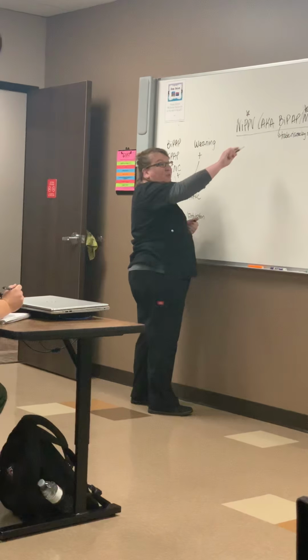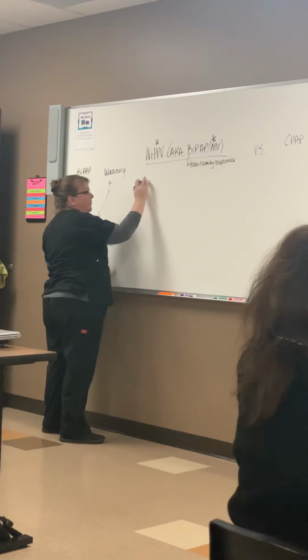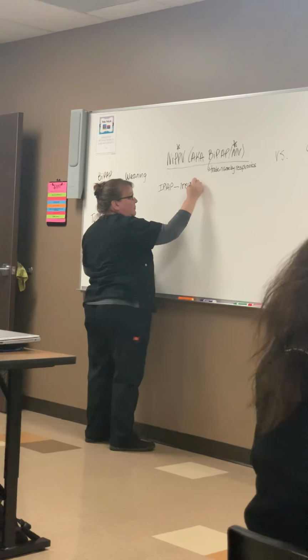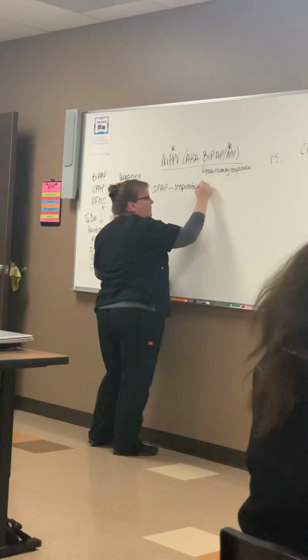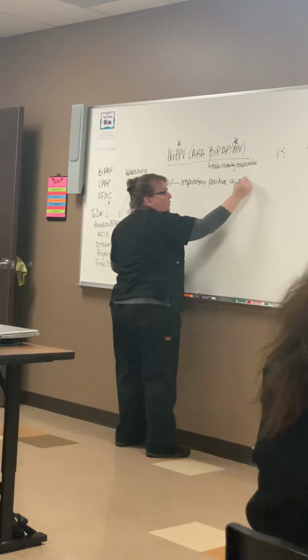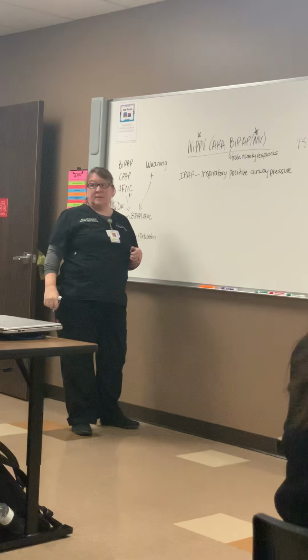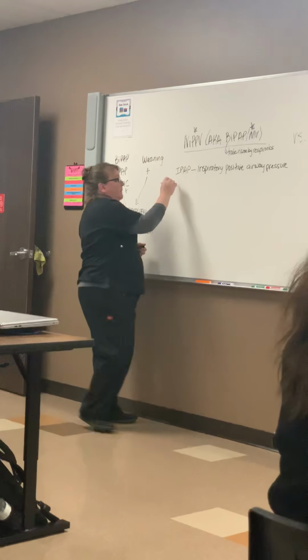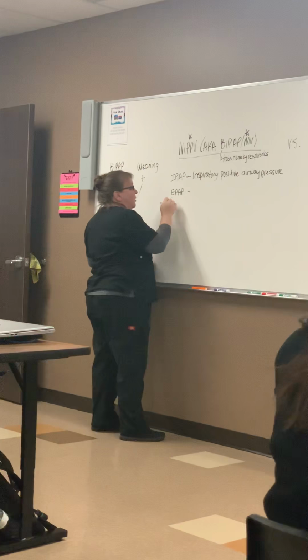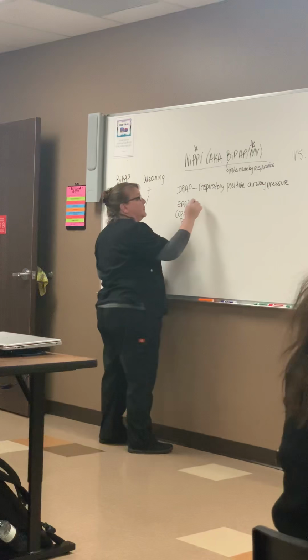So two pressures and one pressure, right? So we have IPAP, inspiratory positive airway pressure. And we're only going to be talking about BiPAP and CPAP use in the acute care setting. We'll talk about home care setting in fifth term, not now. This is ICU that we're talking about in everything for this class. EPAP, remember, is also the same as CPAP or PEEP. Expiratory.